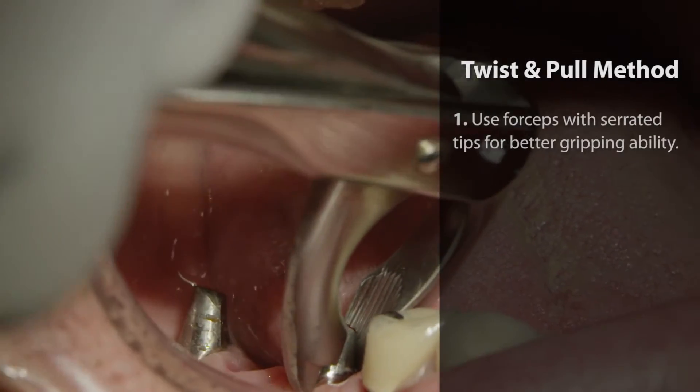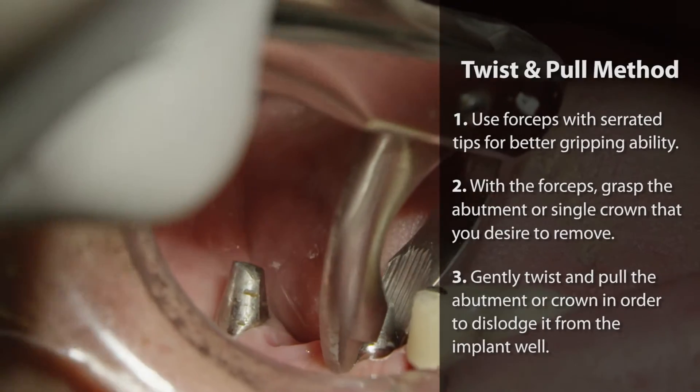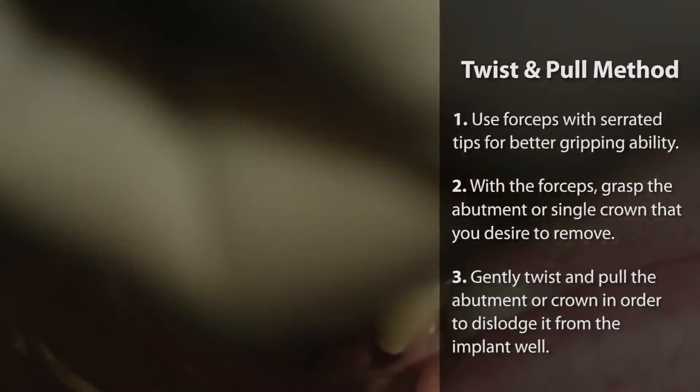The other method is the twist and pull motion. Also using a forceps grasping the crown or the abutment you desire to remove, you do a gentle twist and pull motion and the crown or abutment will be removed.